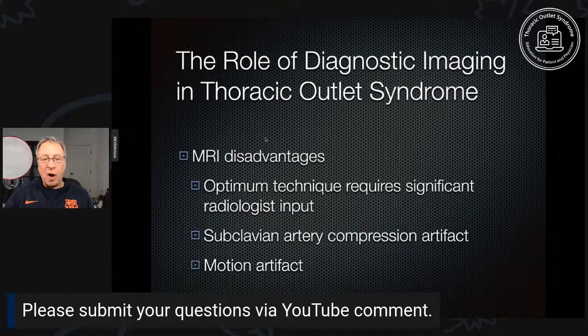The disadvantages are, number 1, it's a very complex technique. The technique I've developed, for instance, has taken a lot of time to develop and refine and keep improving. So just having a technologist isn't enough. You need a radiologist to work with a technologist to make this study really sing and show all this great detail.